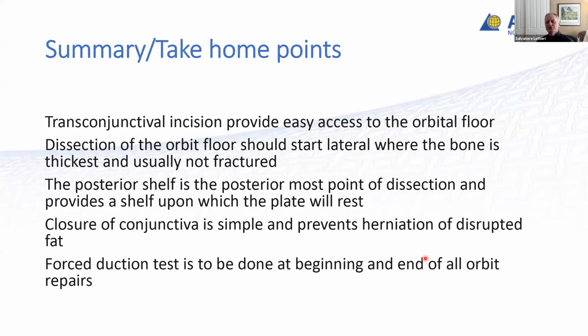There were a couple of questions earlier again about using porous polyethylene or gel film or some resorbable things. I tend to use those when it's a hole, and you really don't have to go by the posterior shelf, and you can just rest it on top. But when you have a very large fracture, you need something in the back against which the plate can rest, as a cantilever stop, if you will.